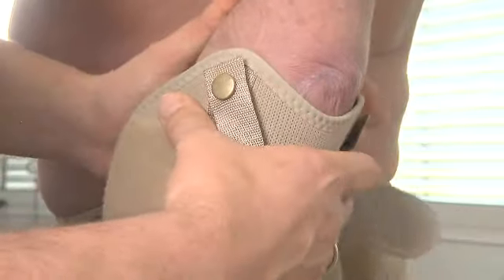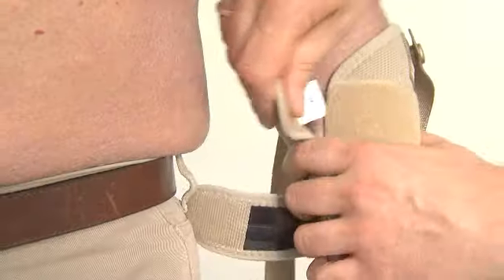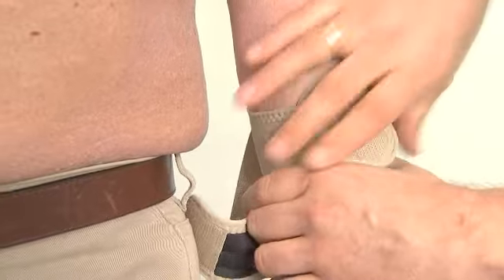Support the patient's arm and apply the lower part. Make sure that the textile leaves the olecranon free. Close the velcro.